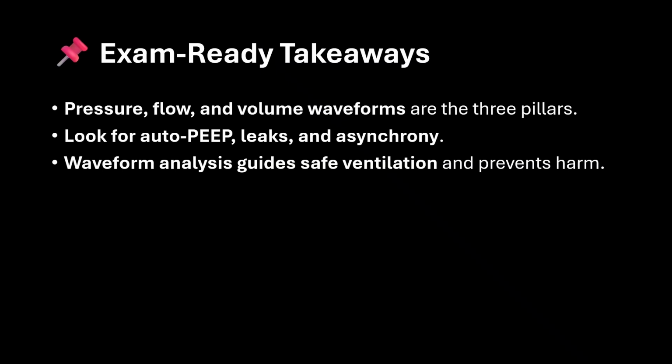So we have finished the pressure-time scalar in our first video, which was quite long, and then we finished the flow and volume scalars in this video, the second part. Now in the third part we would like to discuss the loops.